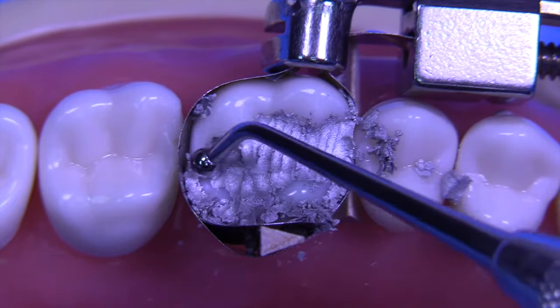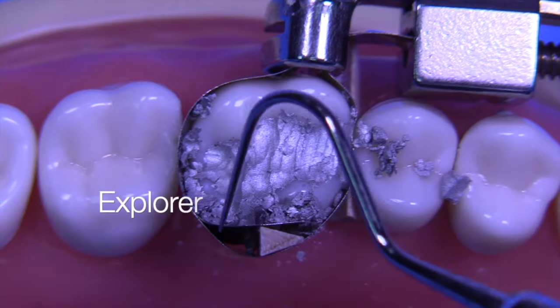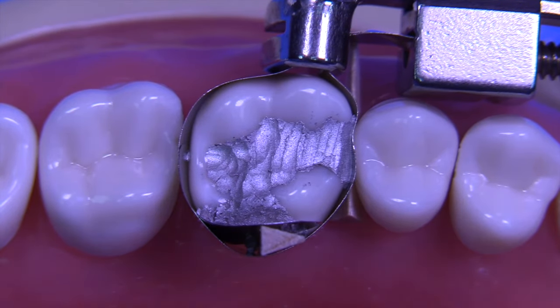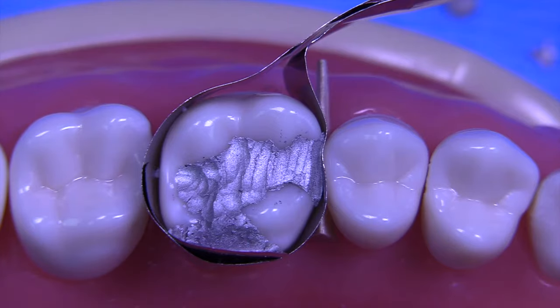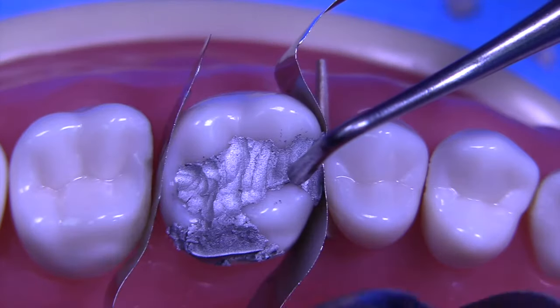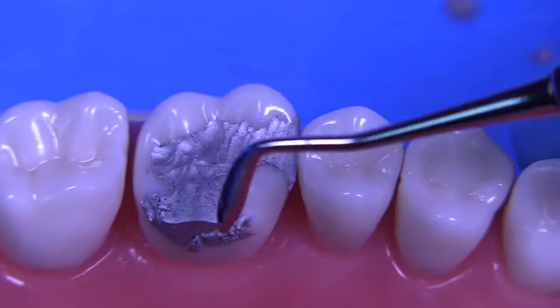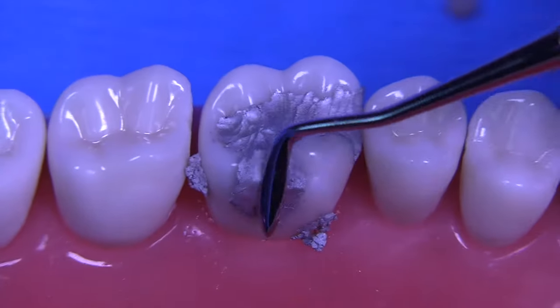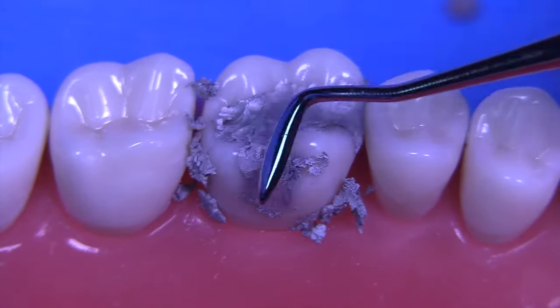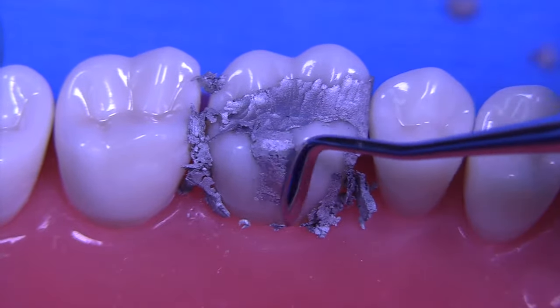The burnisher is used just to confirm the condensation and make sure that we've overfilled the preparation and that we have adequate condensation against the margins. An explorer is used to remove the embrasure area, and now we're ready to remove the assembly. I like to remove the entire assembly right away, holding it down with a little condenser, then rotating out the band with the wedge still in place. The last thing we remove is the wedge. Then we're back to the Hollenbeck carver to start contouring the lingual area, condensing while removing excess — working as a dual-purpose instrument to find the margins.